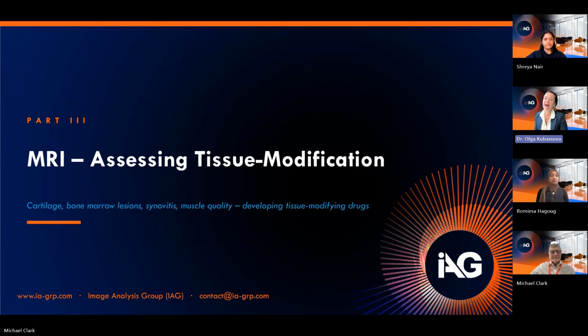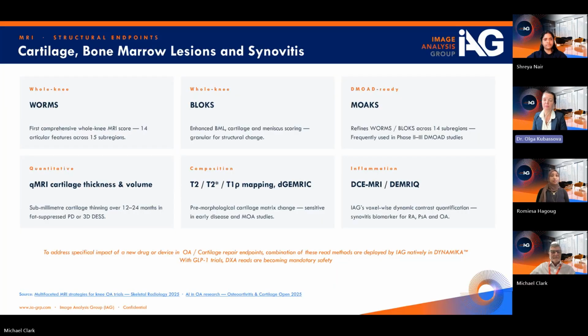Thank you, Michael. Just before I talk about MRI, which is an important modality, let me answer a question which Fatima brought, which is an extremely interesting question here on the chat. And this is about using AI in clinical trials and how FDA would look into the findings generated by AI. So Romiesa spoke about joint space narrowing, which is a very interesting, very time-consuming measure, which is required in many osteoarthritis trials to support claim of disease modification.